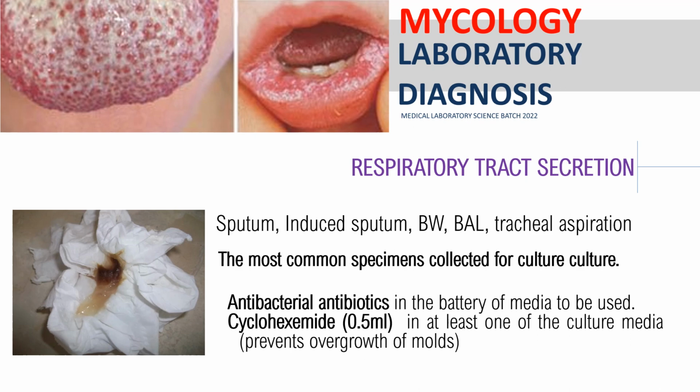And then, one problem din class pagdating sa respiratory tract secretions is that the fungi is too concentrated. So what will happen class? Pag masyadong overgrowth yung molds, we also have a problem identifying that one. We will just try to discuss that one pagdating sa culture.